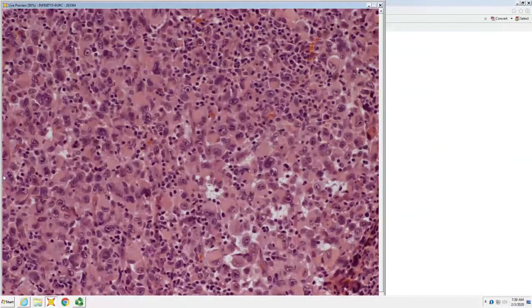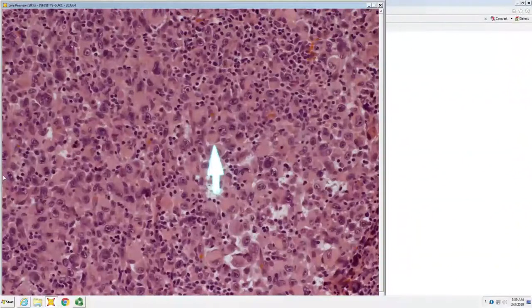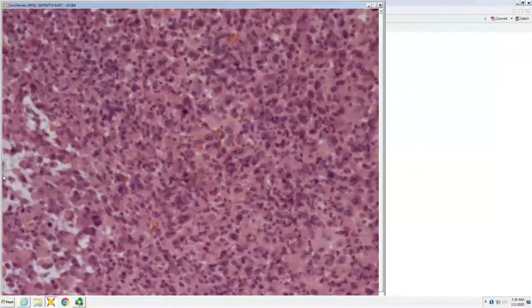Most striated muscle tumors are round blue cell tumors, and then you might get one or two of these, what are called strap cells, where it's forming a rhabdoid morphology. There are primary rhabdoid tumors in skin other than melanoma, but rhabdoid morphology is a big clue to melanoma. These are terms that you're going to see in reports, and so you need to be aware of them.